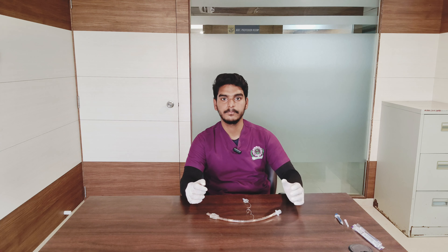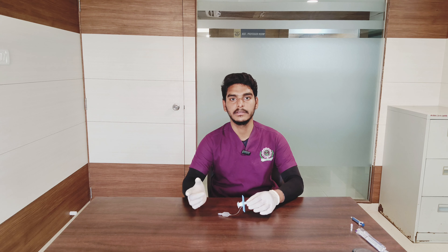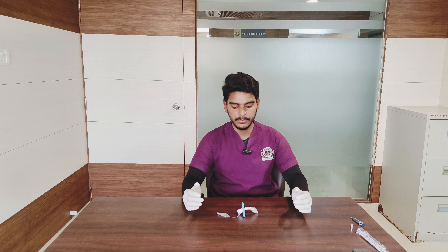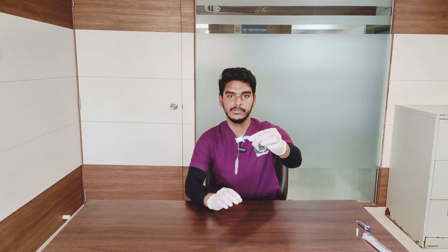The next tube is the tracheostomy tube. Tracheostomy is a procedure where doctors create a hole in the trachea and insert the tracheostomy tube into the airway. Like the endotracheal tube, it also has a connector which is connected to either an ambu bag or a ventilator. The main purpose is to keep the airway patent.